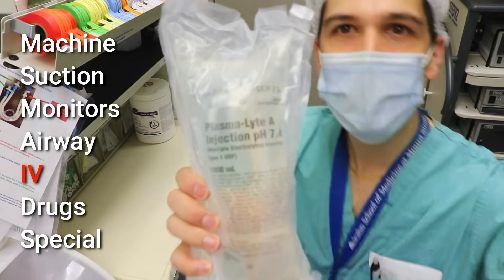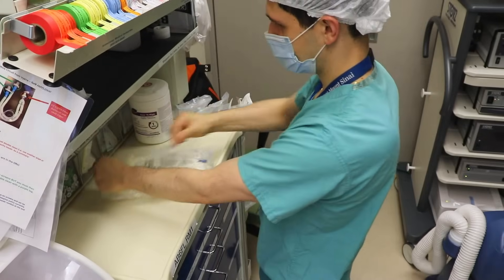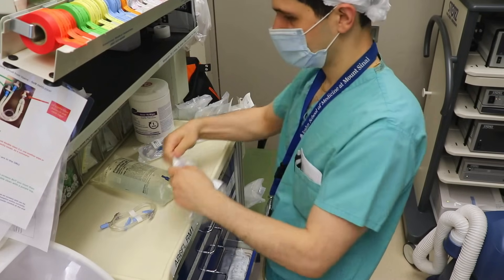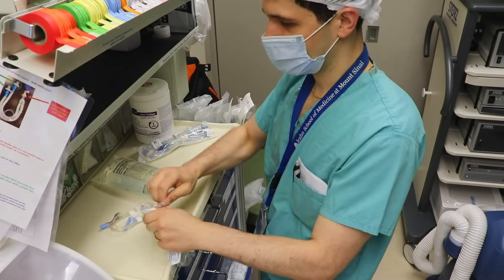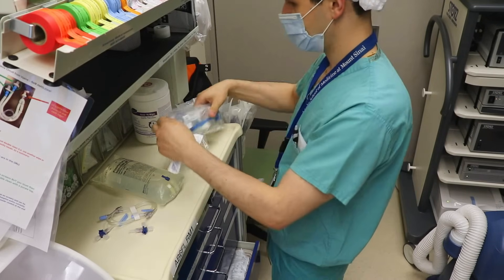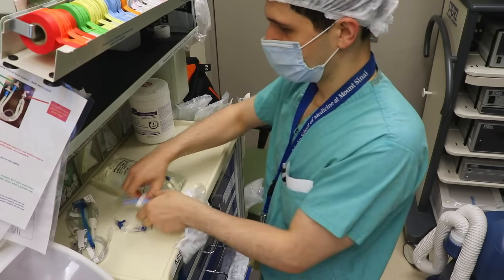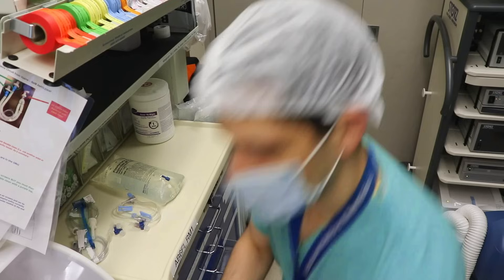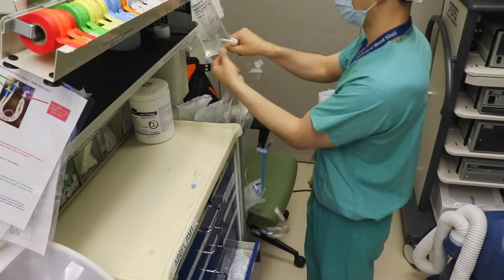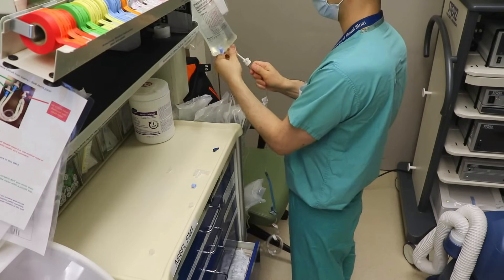Next up is I for IV. I'm going to start with a bag of crystalloid — in this case I'm using Plasmalyte. I like to keep a couple of stopcocks between my IV tubing so I can easily add new lines, inject medication, or disconnect and reconnect the tubing. I'm being extra careful not to touch any part of the tubing that will contact medication going into the patient. I'll go ahead and spike this IV so I can run fluid through the tubing and avoid any air by the time I connect it to the patient.